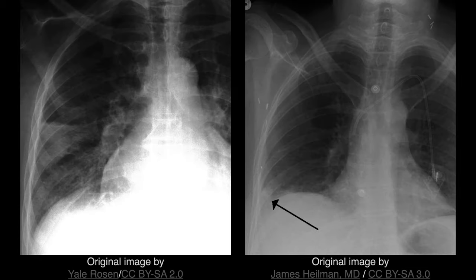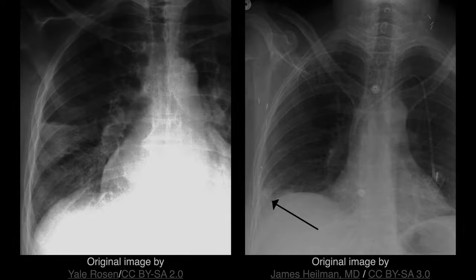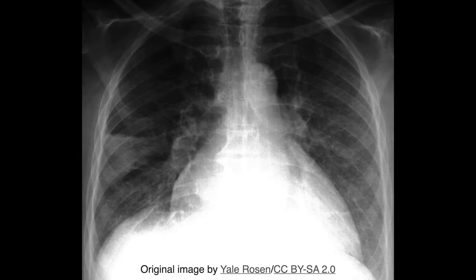The plain radiograph of a patient with a pulmonary infarction can be deceivingly normal, without any striking abnormality identifiable. In this x-ray, we can see a sign that is known as Hampton's hump.